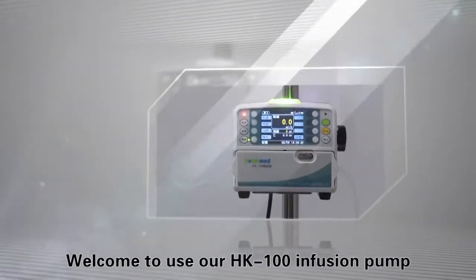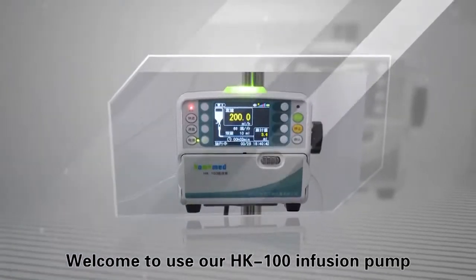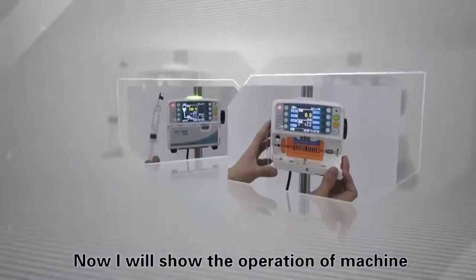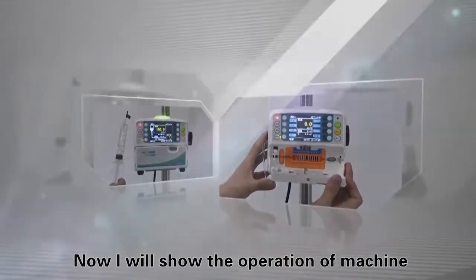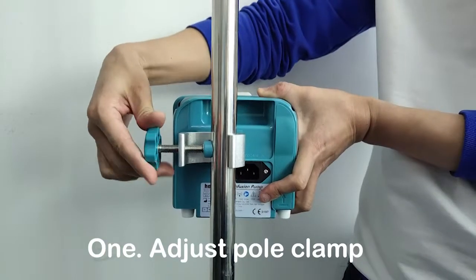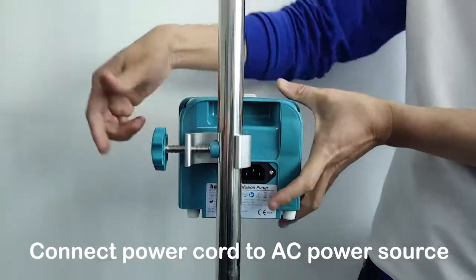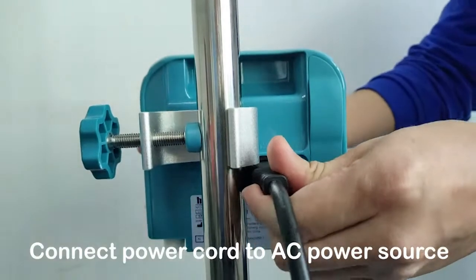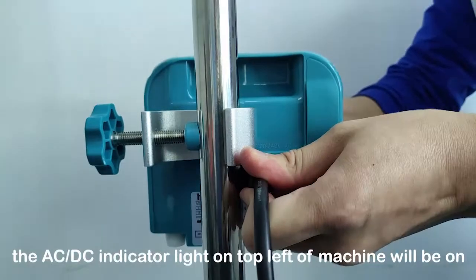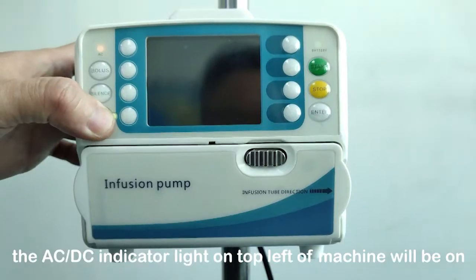Welcome to use our HK-100 infusion pump. Now I will show the operation of the machine. Step 1: Adjust the pole clamp and fix the machine on the IV pole. Connect the power cord to the AC power source. The AC-DC indicator light on the top left of the machine will turn on.